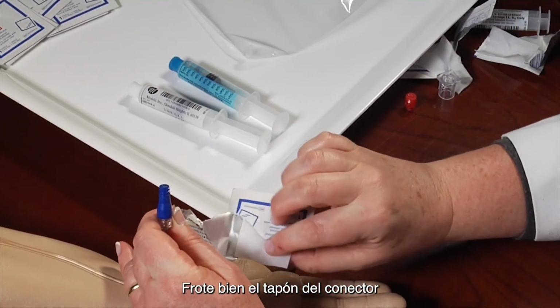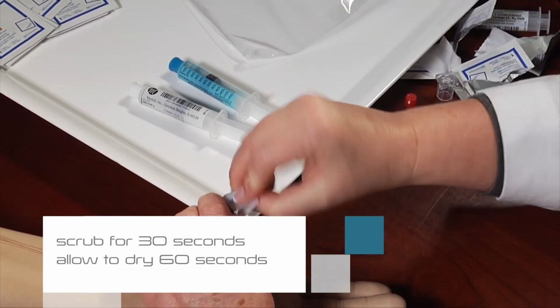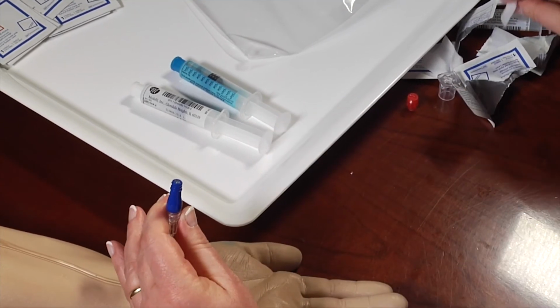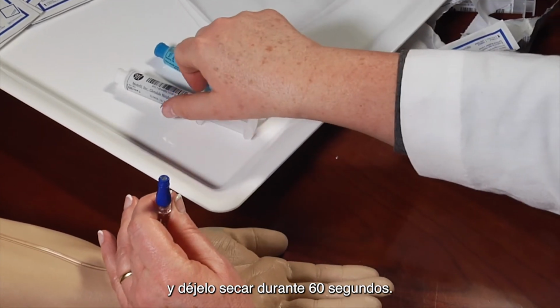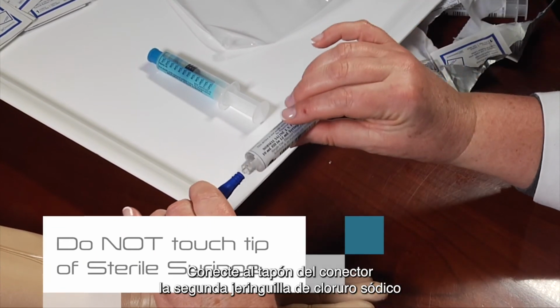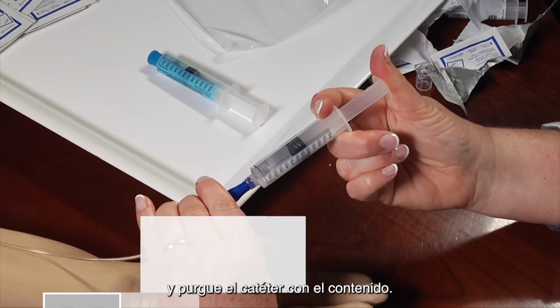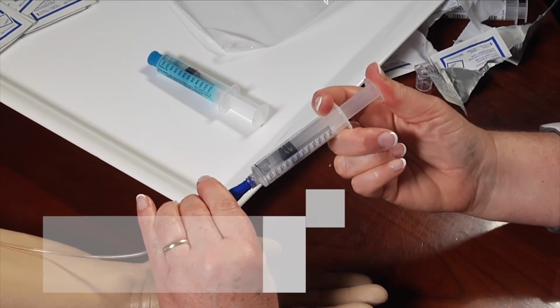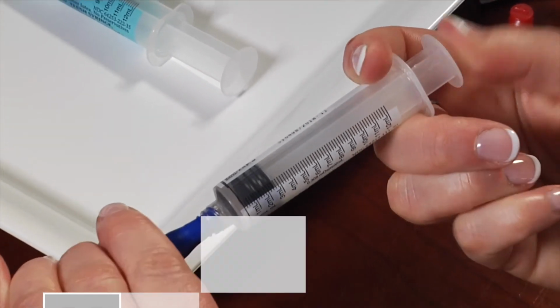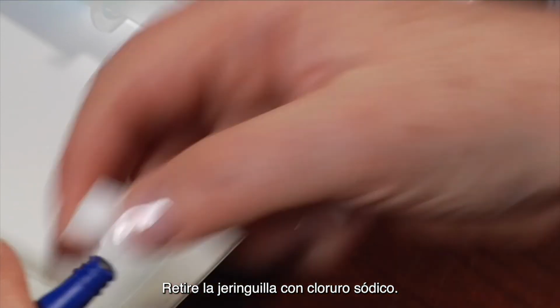Scrub the hub of your injection cap vigorously for 30 seconds with a new antiseptic wipe. Allow to dry for 60 seconds. Attach the second sodium chloride syringe to your injection cap and flush the catheter with the contents. SASH method. S stands for sodium chloride. Disconnect the sodium chloride syringe.